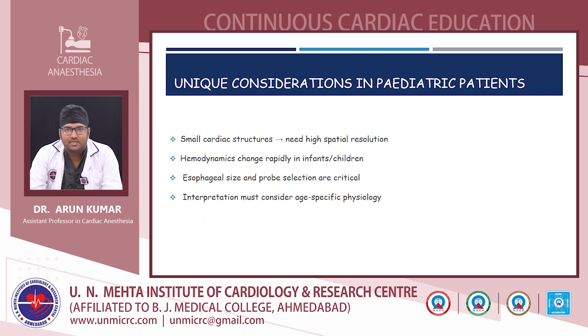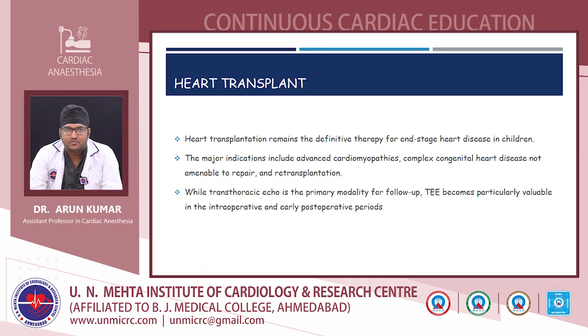And despite these challenges, transesophageal echocardiography offers major advantages, particularly superior visualization of posterior structures, and it also gives excellent utility in mechanically ventilated patients. So coming to the first non-congenital topic, I'll be discussing heart transplant.